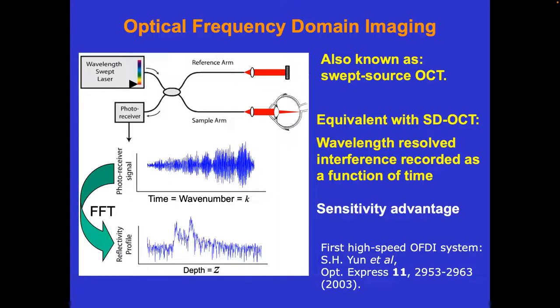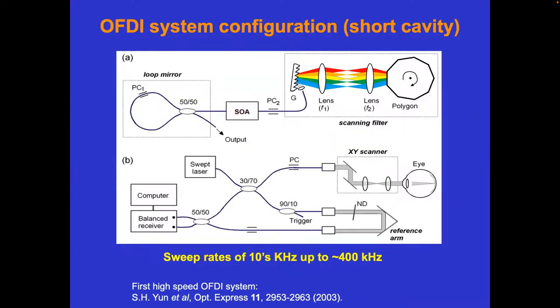So again, this is then an axial measurement when you would do that with such a laser. And I'm not going into details. In the beginning of this century, we built these lasers ourselves. Now we just buy them.